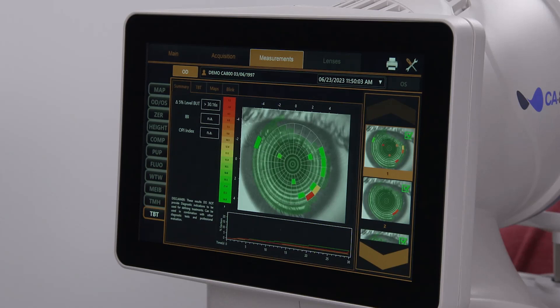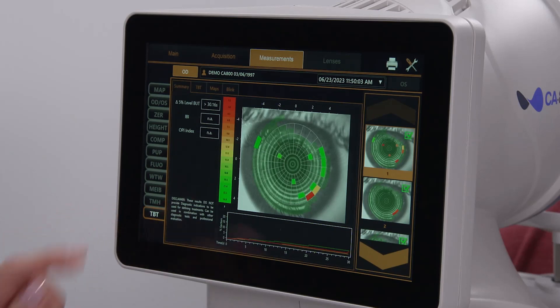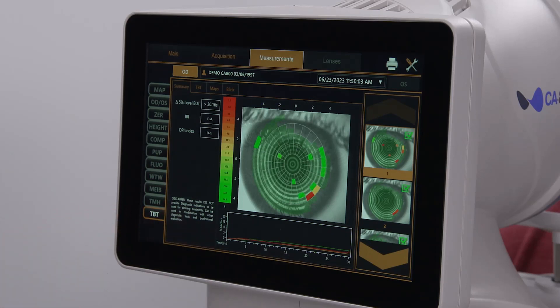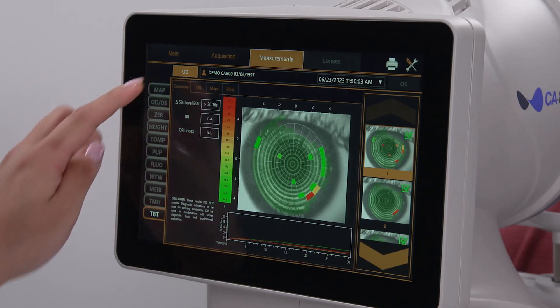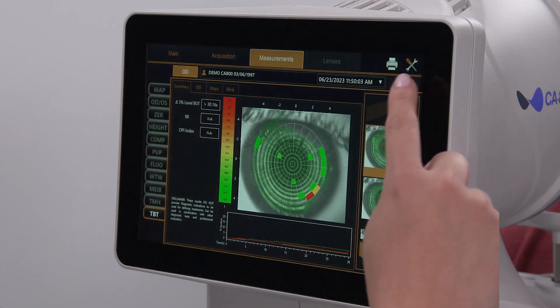To examine the non-invasive tear breakup, select the TBT or Tear Breakup Time tab on the left. Note that this tab will be grayed out if no tear breakup data was acquired for this patient. Select OD to view the right eye or OS to view the left eye.